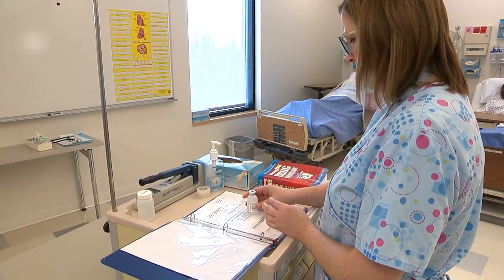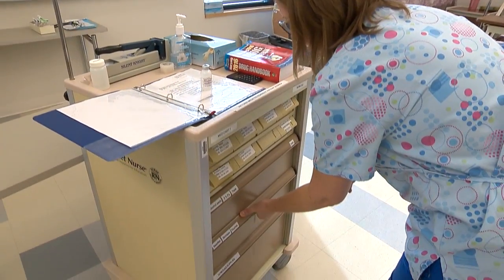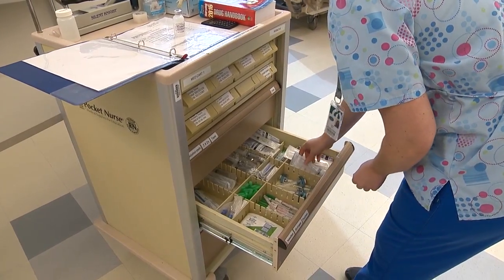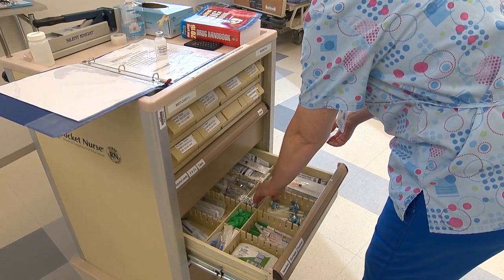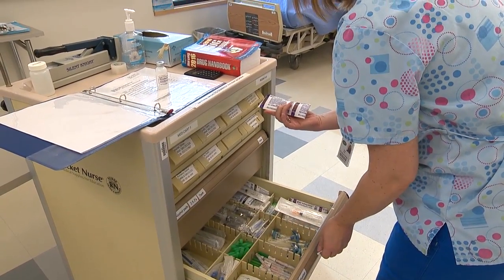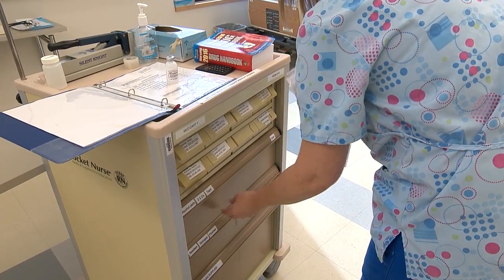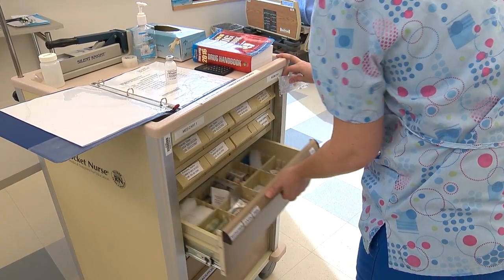Now I'm going to gather my supplies. I need to make sure I grab the right size syringe. Since I'm only giving 1 ml, I don't need a large syringe — I'm going to use this 3 ml syringe. I also need a needleless cannula and an alcohol swab.